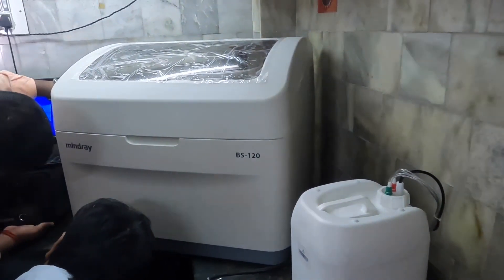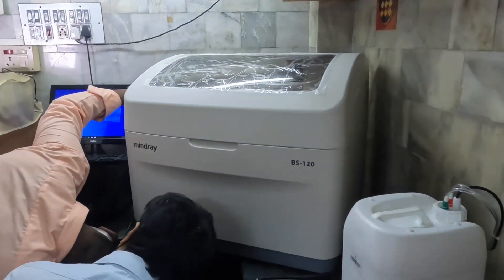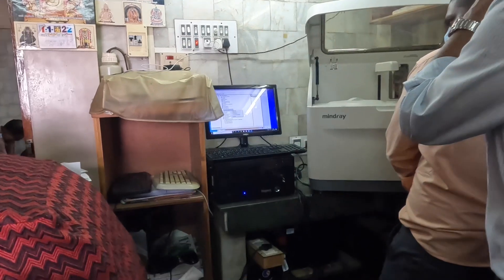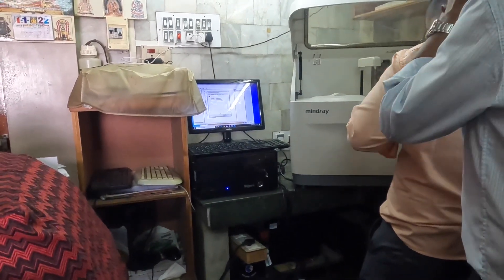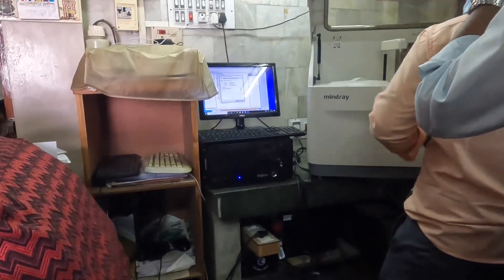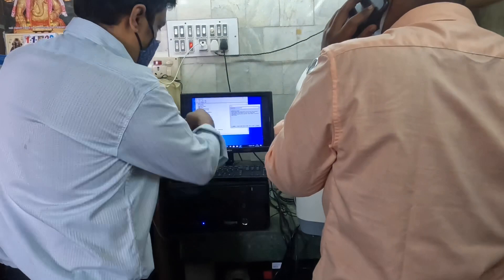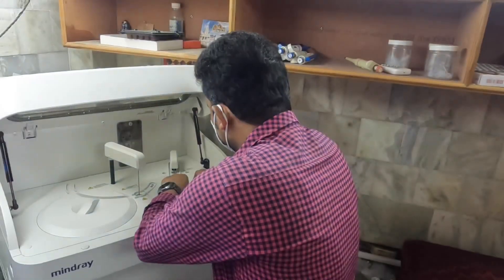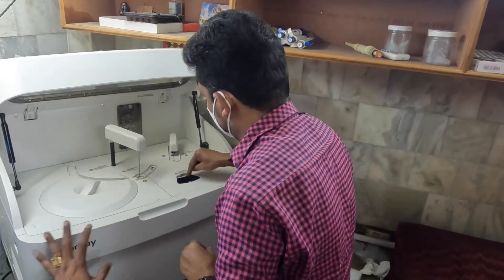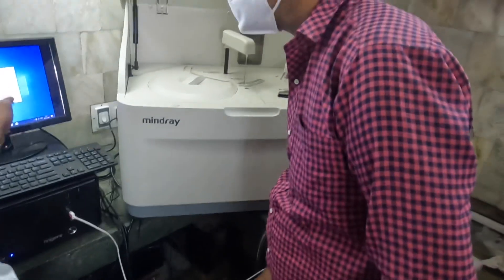This is the distilled water which needs to be present for any automated biochemistry analyzer. The engineers are working on the computer and we have started installing the software. Any automated machine will come with a desktop computer, and the software is getting installed here. You can see the engineers are working on installing the software.